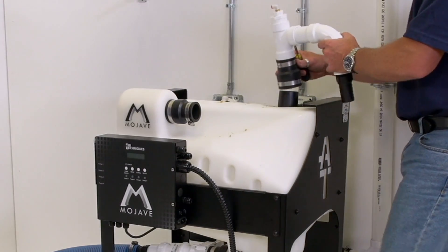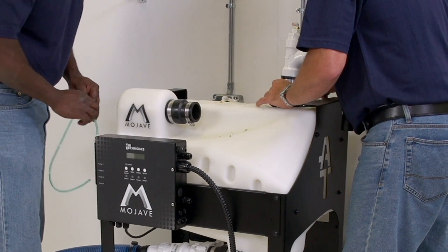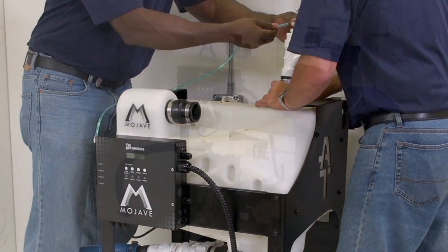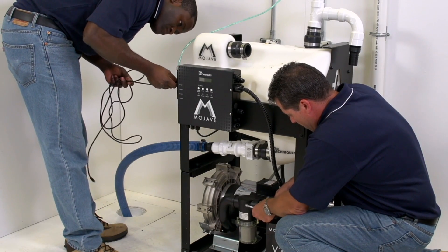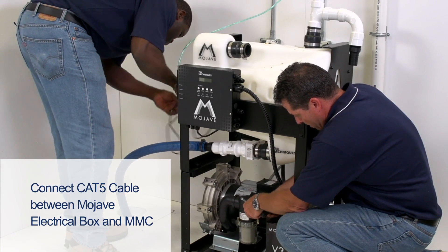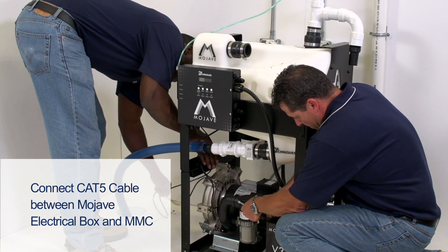After that has been completed, connect the single pump tank outlet assembly while the other installer connects the 1⁄4-inch OD urethane tubing between the vacuum sample port and the vacuum inlet port of the master controller. While one installer works on the connection between the tank outlet and pump inlet, the other installer should connect the RJ45 or CAT5 cable between the Mojave electrical box and the MMC. The CAT5 cable can be found in the pump accessory kit.